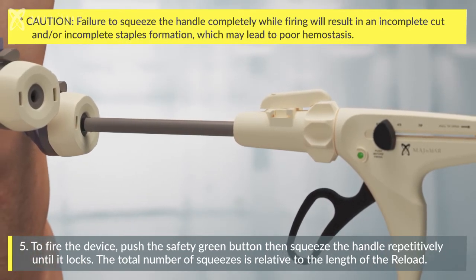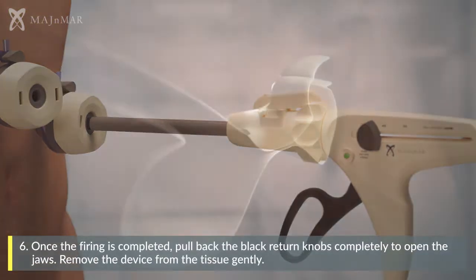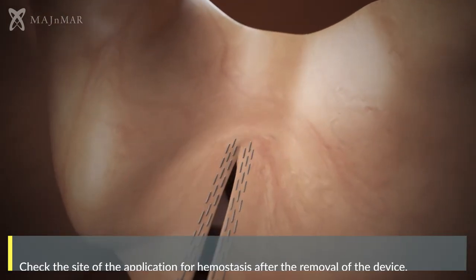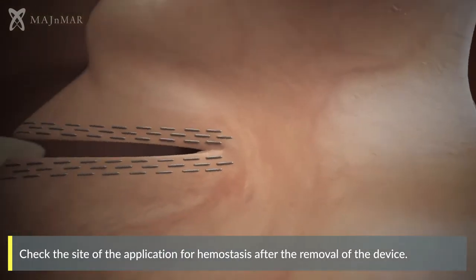The total number of squeezes is relative to the length of the reload. Once the firing is completed, pull back the black return knobs completely to open the jaws. Remove the device from the tissue gently. Check the site of the application for hemostasis after the removal of the device.